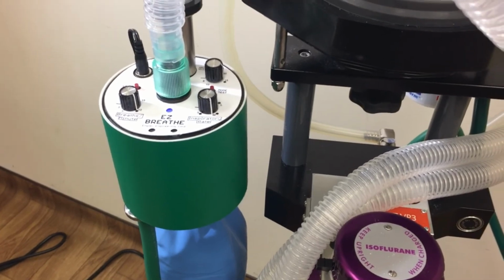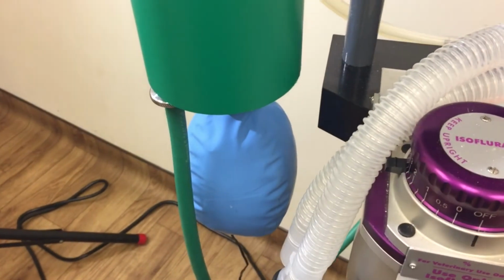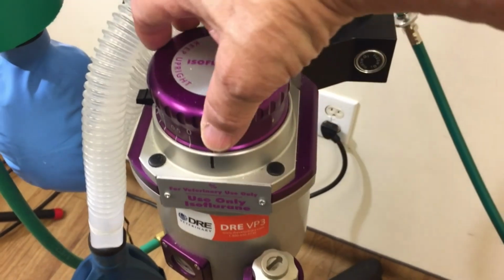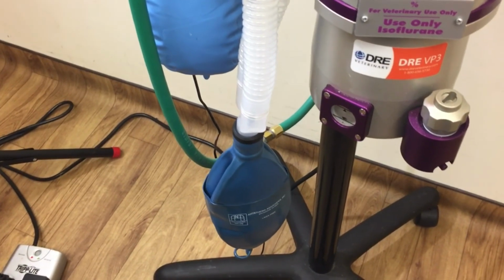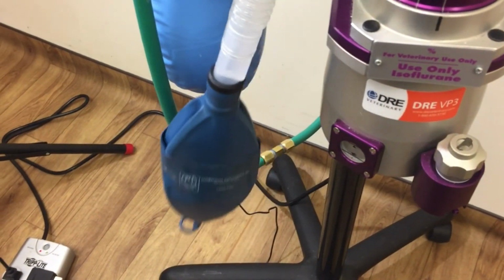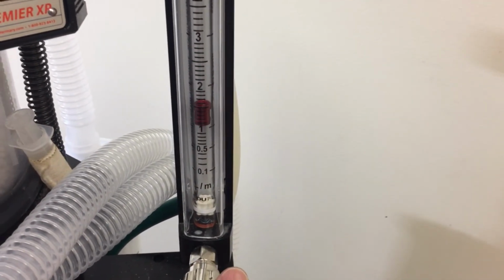To start the ventilator, first turn the flow meter to 3 to 4 liters per minute. The purpose of this is to fill the reservoir bag. You can also adjust the vaporizer to an appropriate setting. The anesthesia machine should now be connected to a patient. In our case, we're using a test lung. Once the reservoir bag appears full, you can turn the flow meter down to about 1.5 liters per minute.